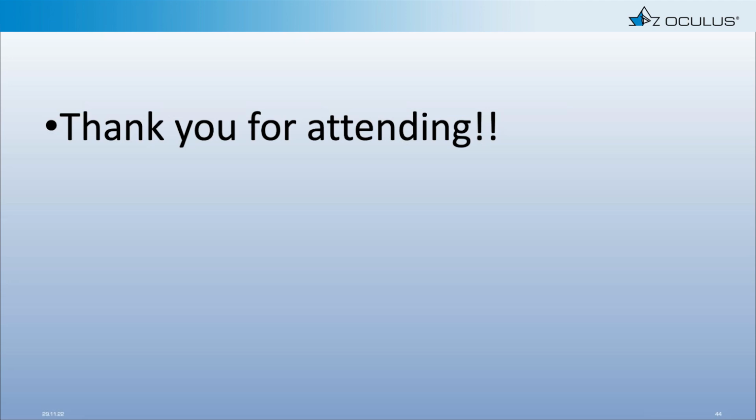What's easier is to say, yes, we can begin now. I'll go ahead and design those custom lenses, and when you come back in a week and they're here, we'll start the process with the first pair already made. And it makes so much more sense than trial and error fitting, and to be able to say it's worth the week of a wait because I'm making custom lenses for your child. It's very well received by virtually every Ortho-K patient and their family when we present it in that fashion.